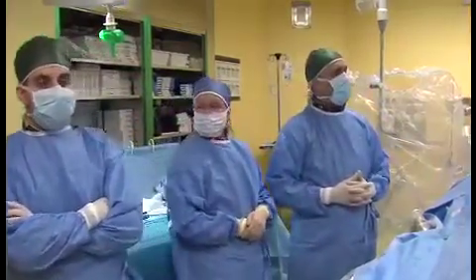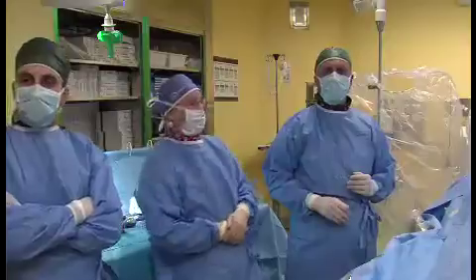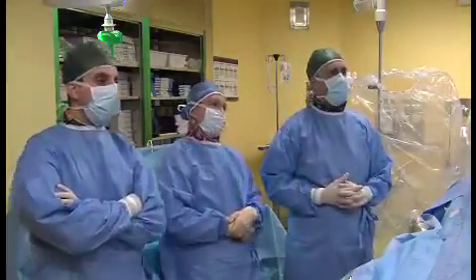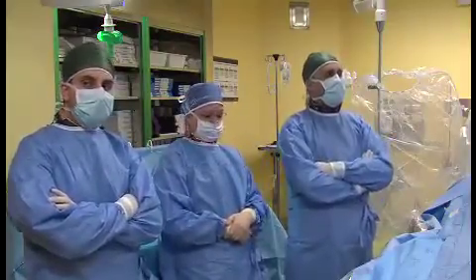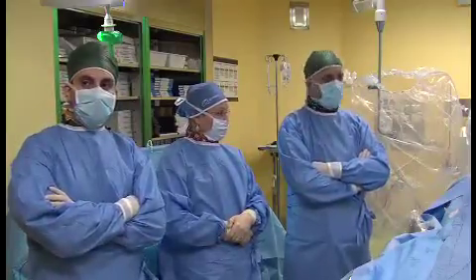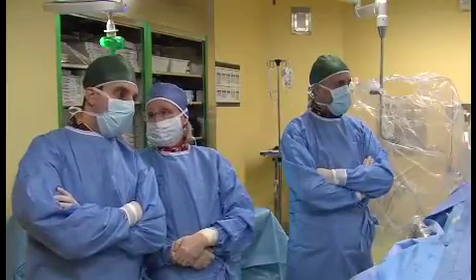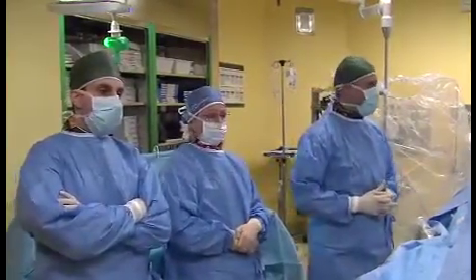Yes, yes. However, we know that right and left pulmonary arteries are not arising symmetrically from the main trunk. They arise from different directions, so it's going to be very difficult or even impossible to follow not only the size, but even more the direction of the origin of the right and left PA, right? Yeah, and that's what's going to be challenging, because at the moment, the anatomies that we've dealt with are the ones where the branch pulmonary arteries are at a fairly similar level rather than one anterior and superior. So, yes, there will be some technical problems with that sort of anatomy.